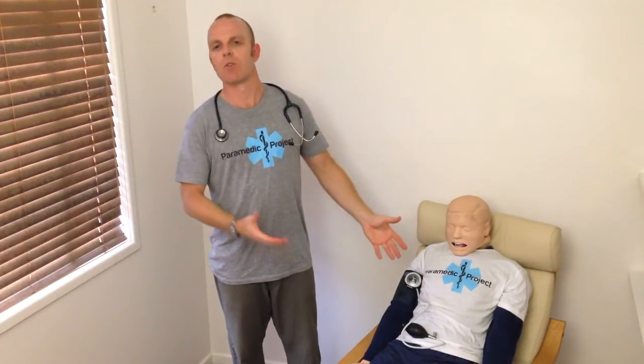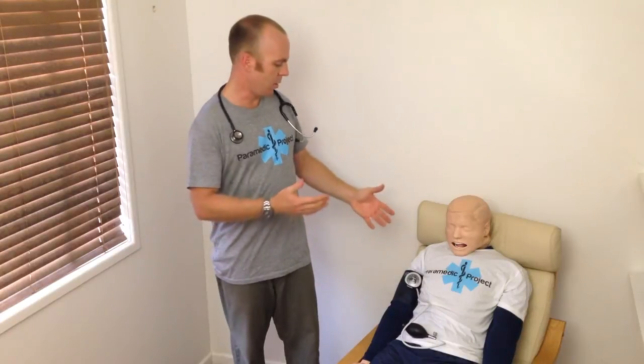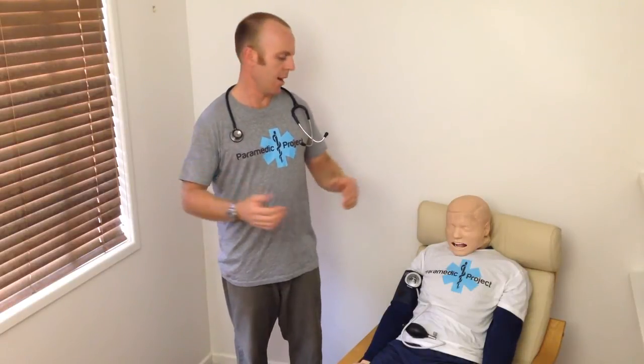Well, doing a manual blood pressure is no different. If you expect to take an accurate manual blood pressure the first time you get to a really sick patient when you've never taken one before, that's not a realistic expectation. You need to practice this on every patient you go to.